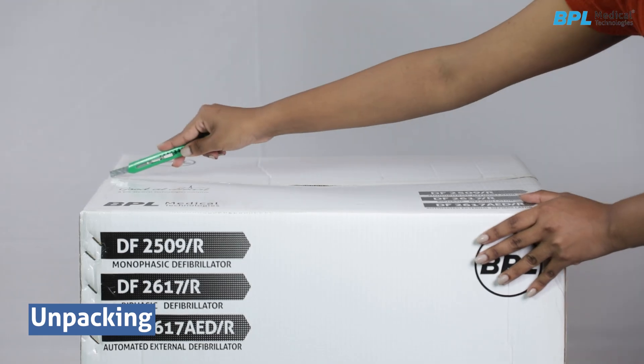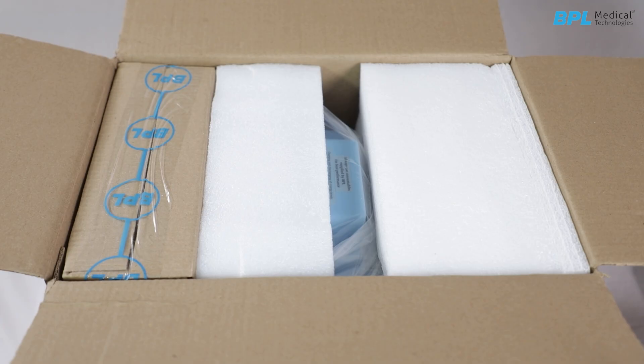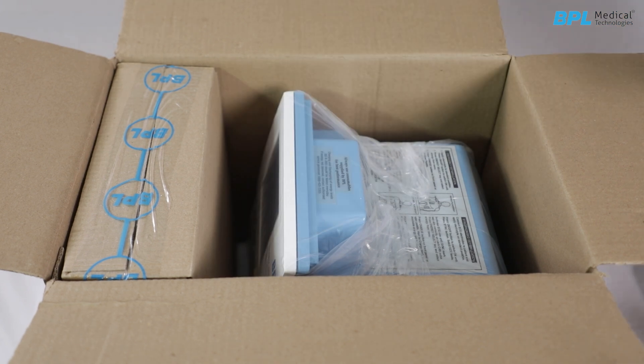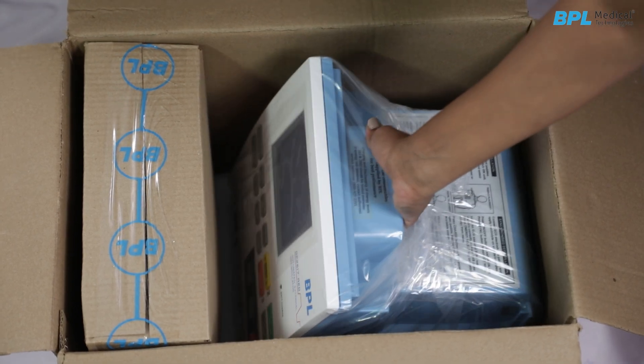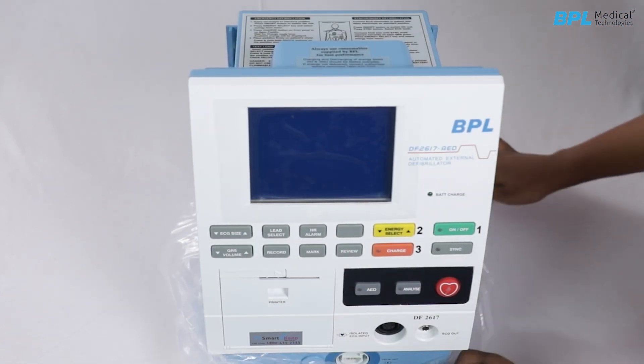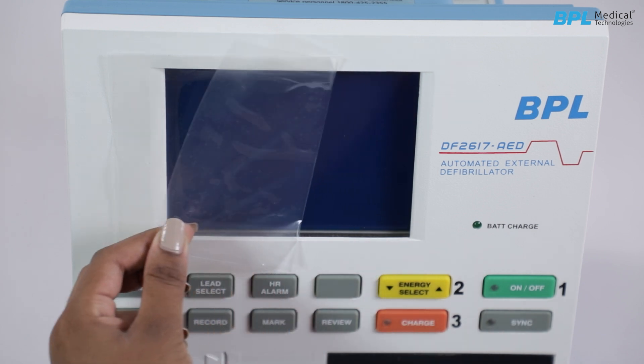Unpacking: Keep the carton box upright. Remove the packing tape and open the flaps to access the accessories carton box. Lift the unit and remove the polythene cover. Check for any dents, scratches, or other mechanical damages. If evident, please notify BPL or the service team.